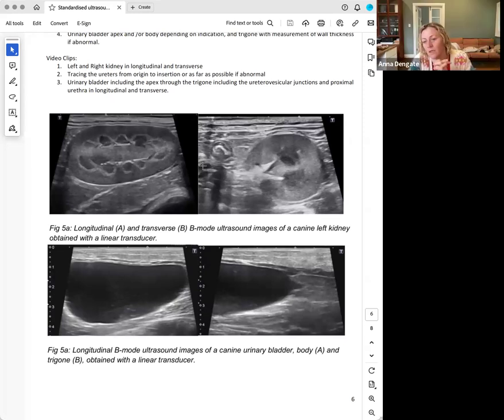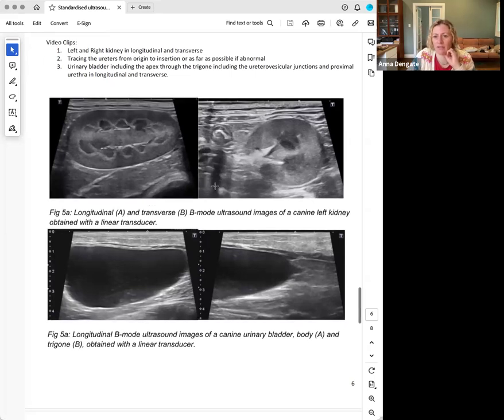Very normal, yeah. Particularly in the patients that we're scanning. So particularly in cats, we see it all the time. It's typically fat that's been deposited at that level. For some reason, fat just gets deposited there. And it's usually when there's been a period of anorexia or weight loss that we see it more prominently. But certainly can see it in completely normal patients or patients with quite profound kidney disease. It's not a specific marker, but something we see as a variant of normal.